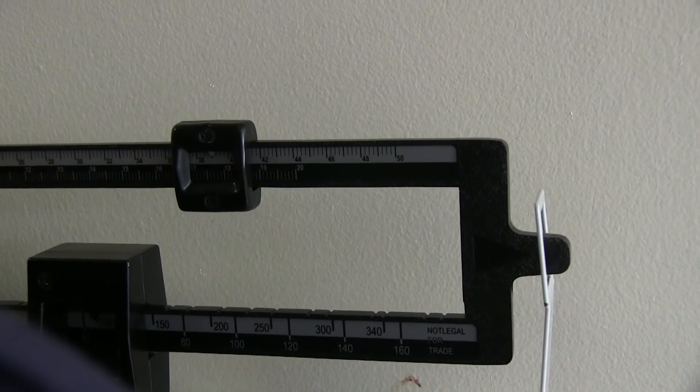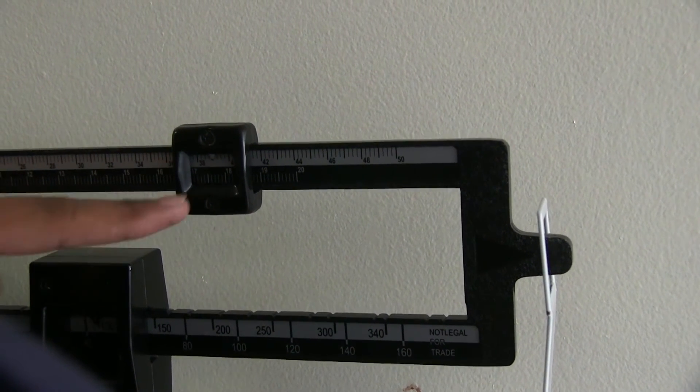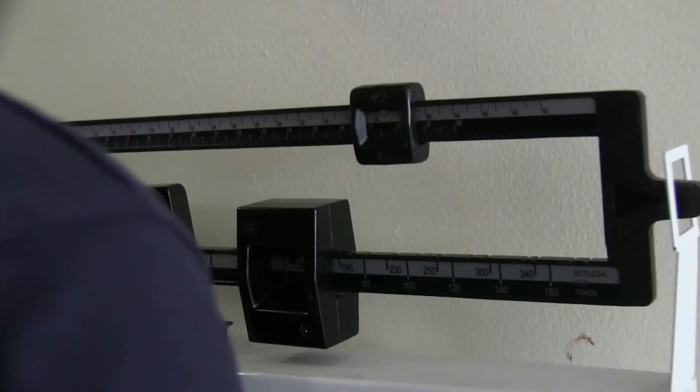So we can say for this patient, it's about 139, so I'll write down the weight 139 onto the chart.